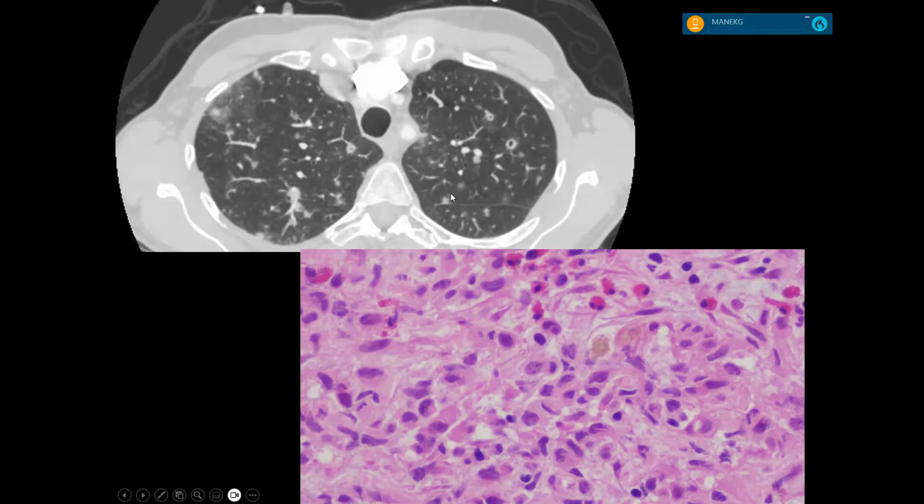What's the size, do you think? Is it 2, 3 centimeters, 5, 6? How big are these? Less than 1 centimeter? They're millimeter size. Millimeter-size bilateral nodules with this kind of donutty sign and ground glass opacity. I am surprised you don't already have a diagnosis based on that. You don't need the H&E, and actually it would be unfair to have you make the diagnosis from the H&E. Should I give you the stem?